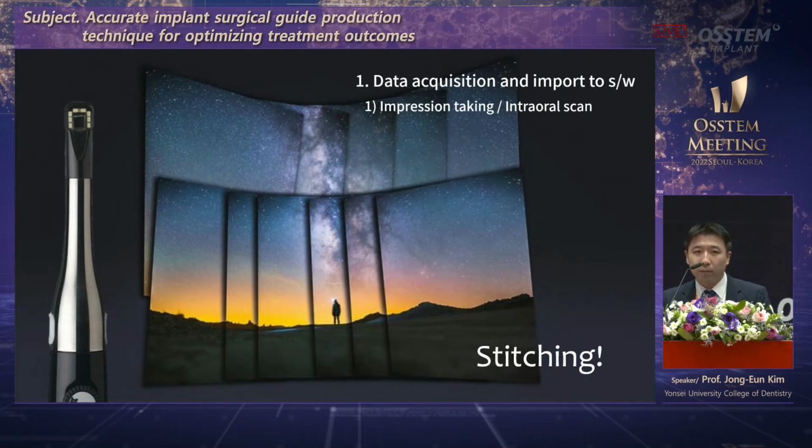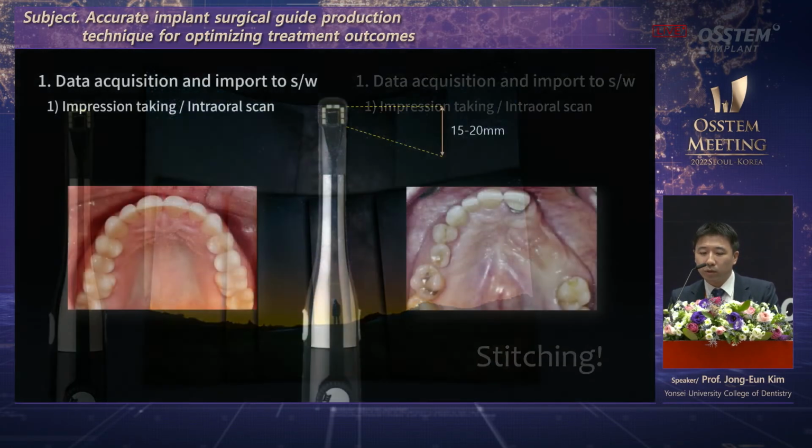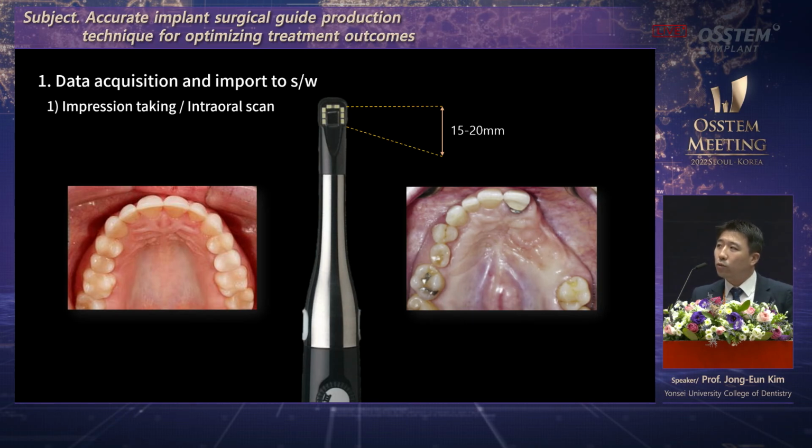Dr. Hee-cheol Kim is going to talk about this, but as you all know, stitching process is necessary. Multiple data needs to be stitched to get three-dimensional data, and how precise the different images are, and how well it is stitched determines the quality. If there are multiple landmarks as shown here, you can get more precise data.